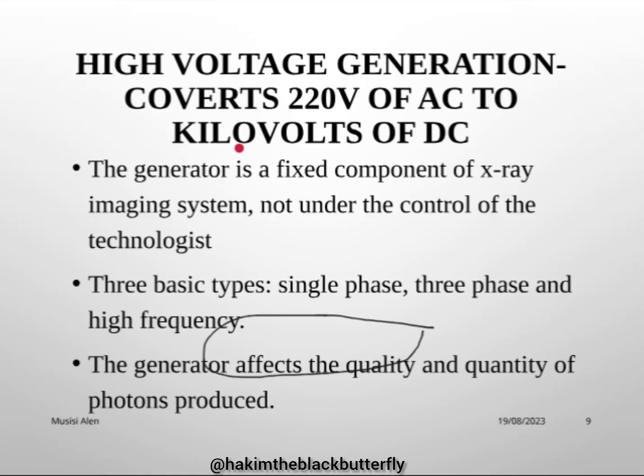Now, we have three types of generators. We have a single phase, we have three phase, and we have high frequency generator.